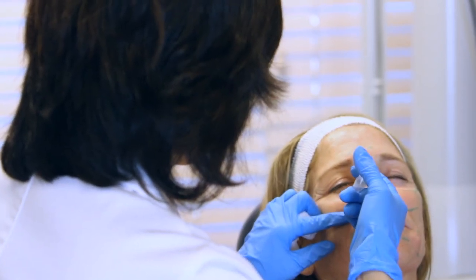Secondly, we've got to numb the whole area because it is a fairly uncomfortable procedure, but with proper numbing it's fairly comfortable.